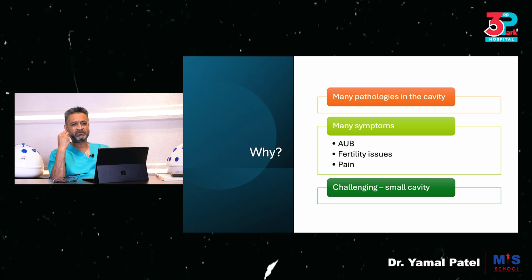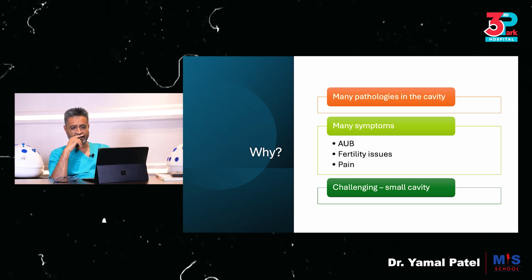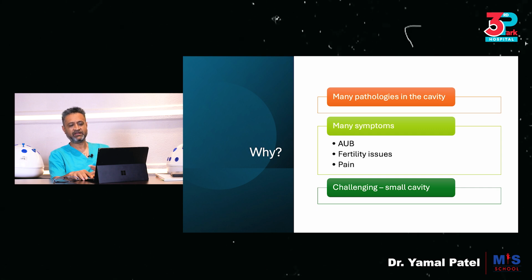So why is operative hysteroscopy something we need to understand? The reason is, number one, there are very many pathologies in the uterine cavity that we should know about. And there are very many symptoms that these pathologies will cause, ranging from abnormal uterine bleeding, to fertility issues, to pain, to very many other different symptoms. And operative hysteroscopy is something we need to understand because it's very challenging.